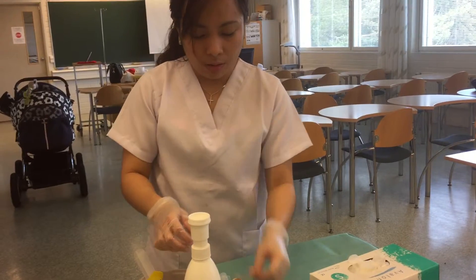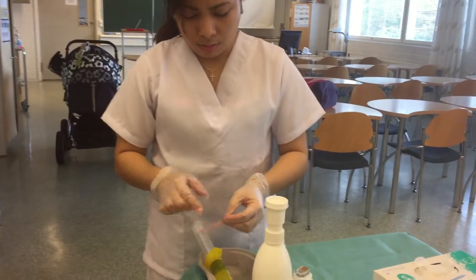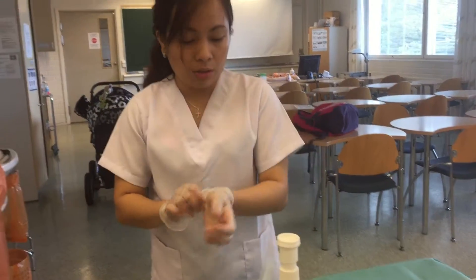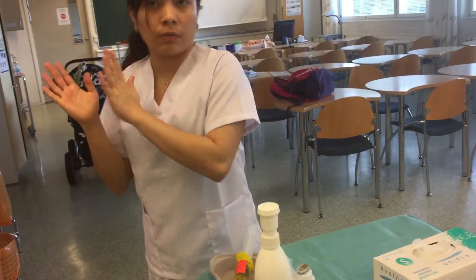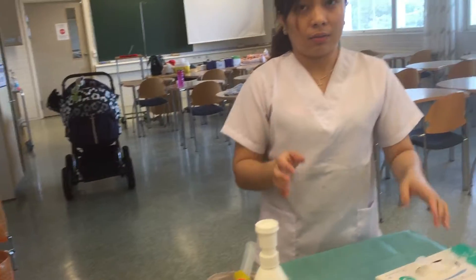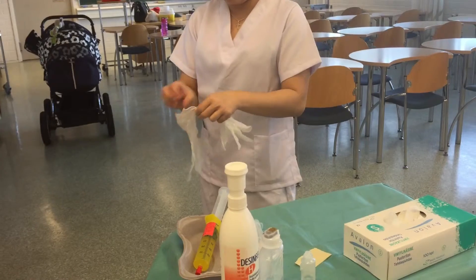Now you can put the label on. Then you have to remove your gloves, wash your hands, and disinfect your hands. Then put on a new glove.